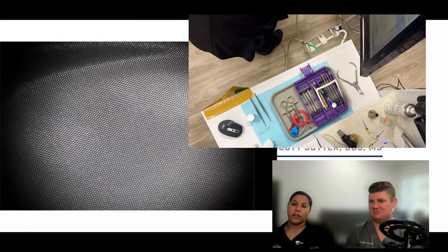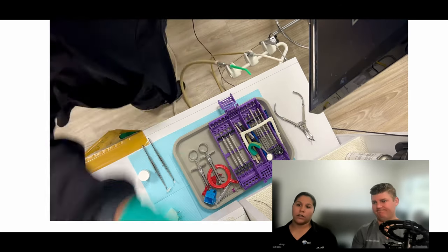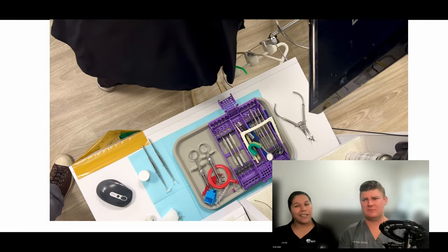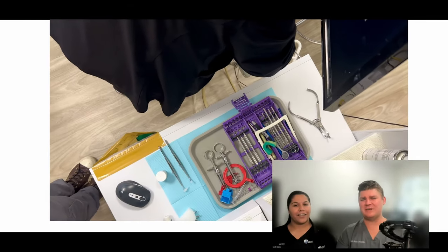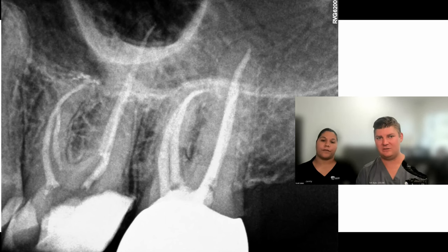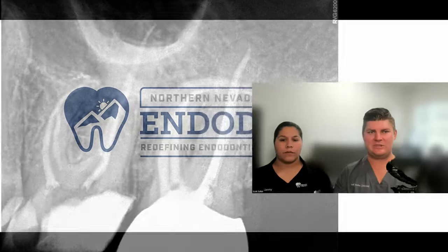Just a big rinse, then I'll back out, take the x-ray, and that's everything. On Jenny's side you see a little more work — suction, rubber dam removal, taking out the bite block. She grabs the x-ray sensor, takes the x-ray, and it pops right up in the software. We use the Cocoon — it's like a Nomad but a different brand — and it's actually lighter. It does talk to you, which is kind of weird; you can turn most of it off. So that's the case — start to finish in about 14-16 minutes. It shows you that you can still do really high-quality root canals, and as you can see from the x-ray it looks really solid.